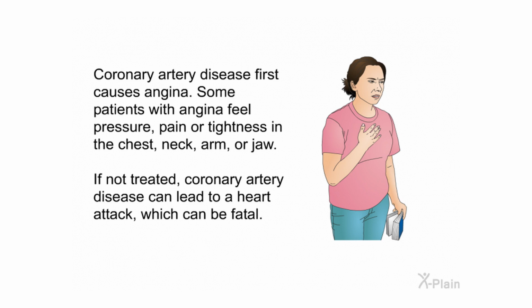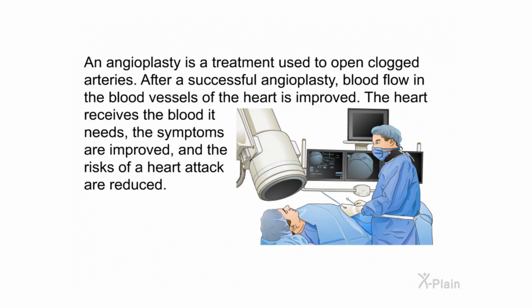Coronary artery disease first causes angina. Some patients with angina feel pressure, pain, or tightness in the chest, neck, arm, or jaw. If not treated, coronary artery disease can lead to a heart attack, which can be fatal. An angioplasty is a treatment used to open clogged arteries. After a successful angioplasty, blood flow in the blood vessels of the heart is improved. The heart receives the blood it needs, the symptoms are improved, and the risks of a heart attack are reduced.